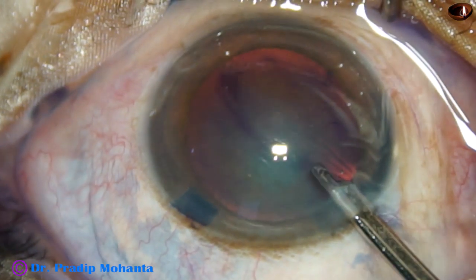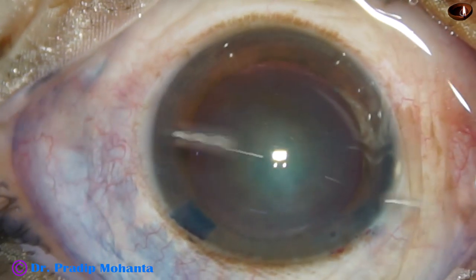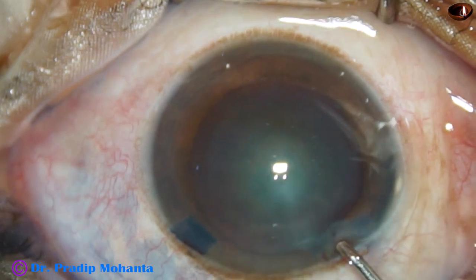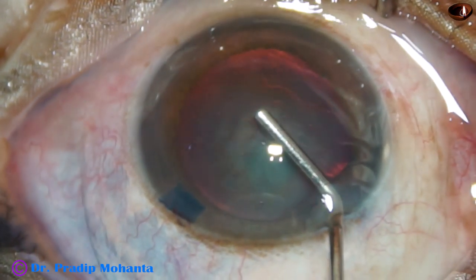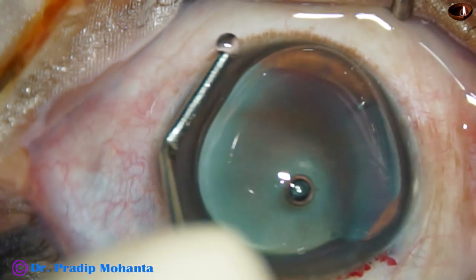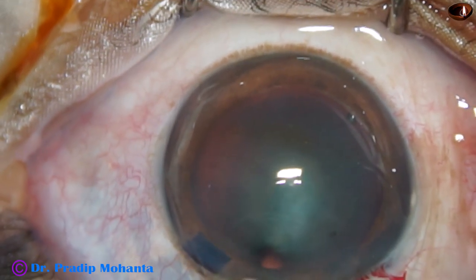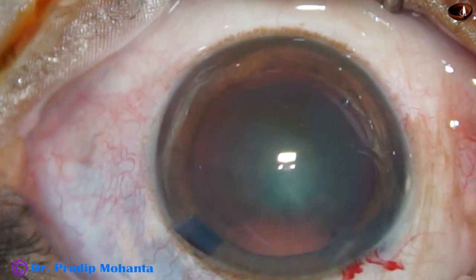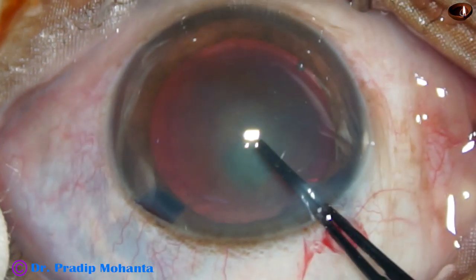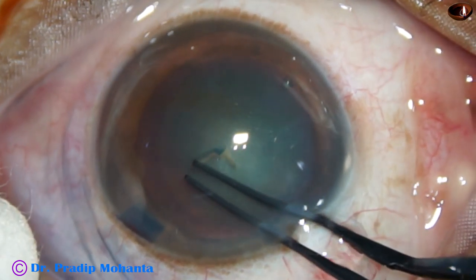There may be some particulate matter in the dye which should come out. Now 2% HPMC — hydroxypropylmethylcellulose — is used to fill the anterior chamber. The HPMC is also applied over the cornea for better visibility, and it protects the corneal epithelium very nicely. Now capsulorhexis is begun with Utrata forceps — the anterior capsule is scratched and a capsular tag is raised.